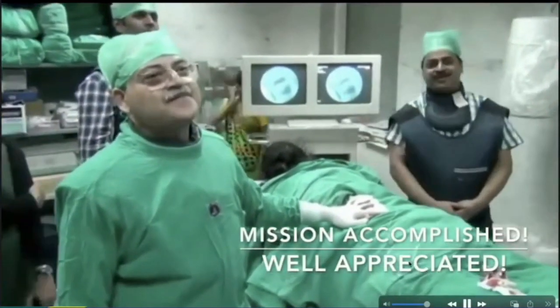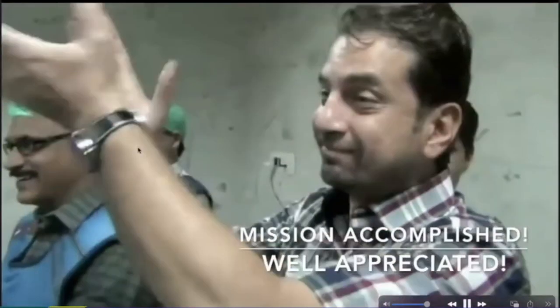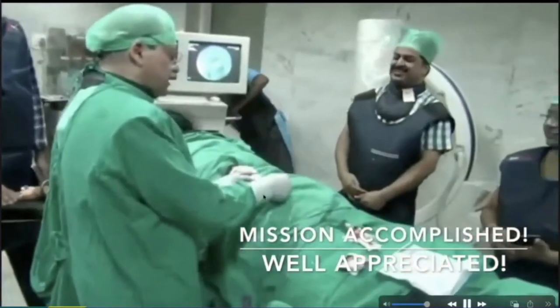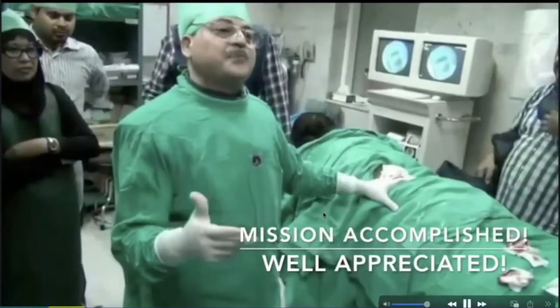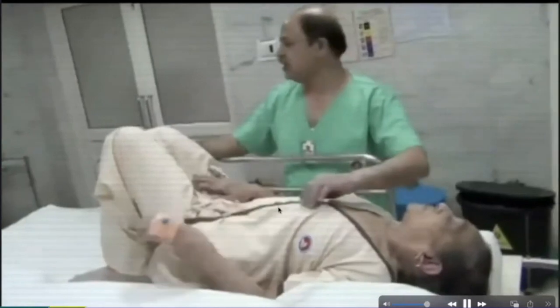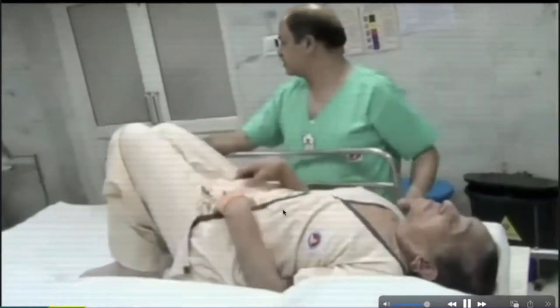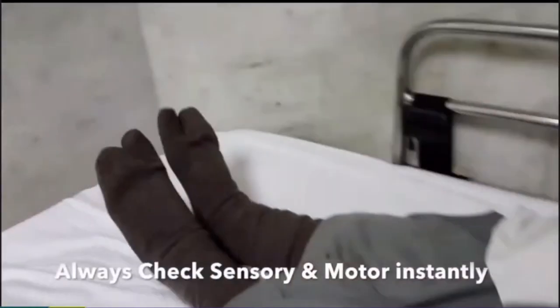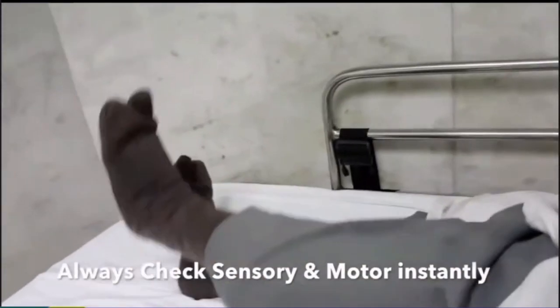So one of the workshop people appreciated it because it's a very, very special case. I show them balloon, kyphon, kyphoplasty, epidural balloon, everything, and it's a very nice fill. And you just check this patient on table, you know, if there is relief. So the patient is able to shift, move, sensory motor check is there. And it's a very tiny incision, you don't see. Must check the patient on table. I'm doing it on trolley, but do it on table as well. So everything is in shape, everything is okay.